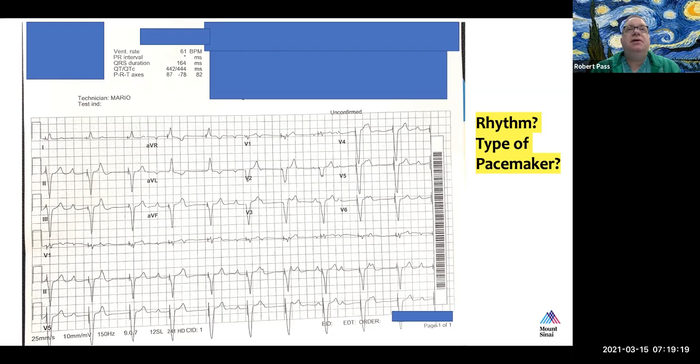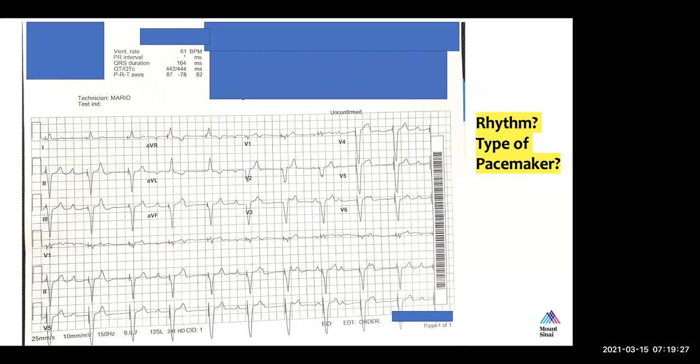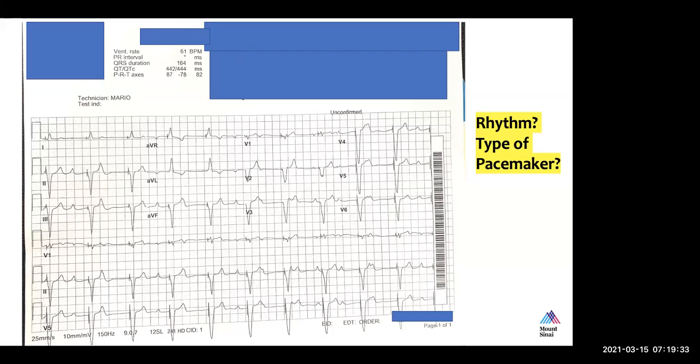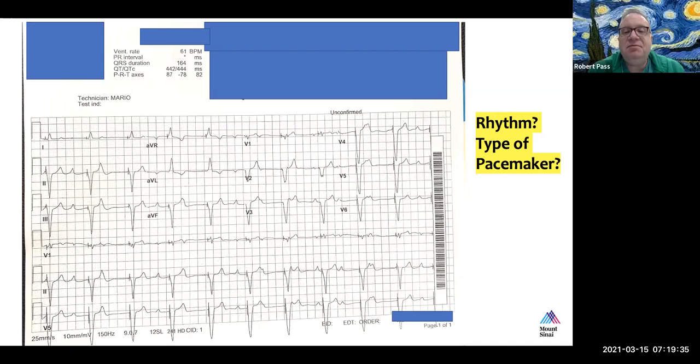I see. Except that if you have a single chamber pacemaker, it doesn't have to sense the atrium at all, and you would be pacing the ventricle 100% in either approach, right? So it should be roughly the same in terms of battery life.